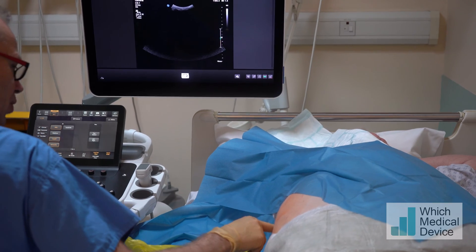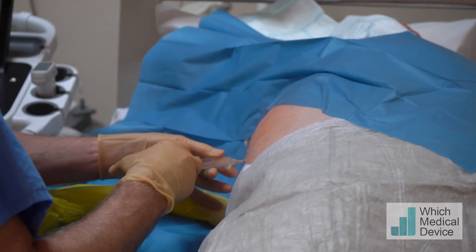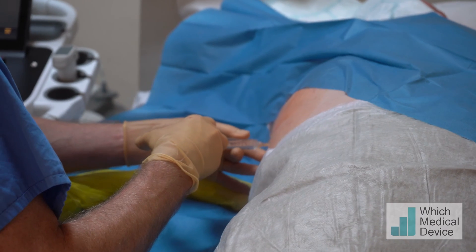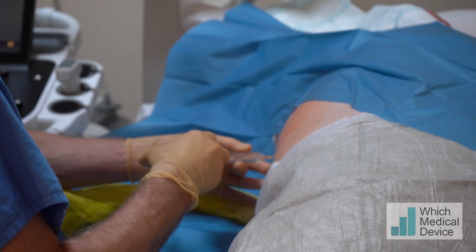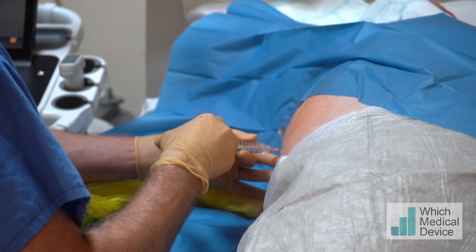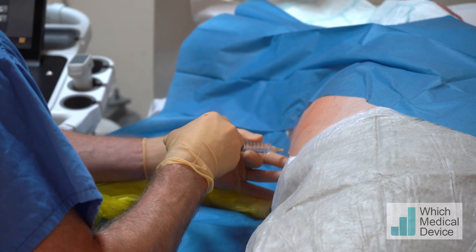I'm going to put some local anesthetic in now — it's just going to feel a little bit sharp. There's a sharp sting now, and I'm injecting the local anesthetic very slowly because this first bit can be uncomfortable otherwise. Once I've got that first bit in, I'm going to change to a green needle so it can go all the way down to the liver capsule.